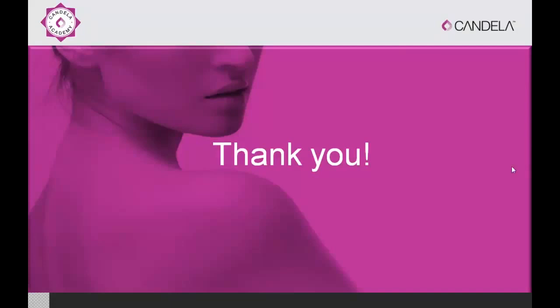That depends on the ink, obviously, but you can do a spot test and look for that. And even if it does oxidize and turn darker, that doesn't mean it cannot be amenable to further treatment. You can try and treat again, and some do respond to the 1064 when they darken. The other way is to combine with the fractional CO2, as I mentioned.